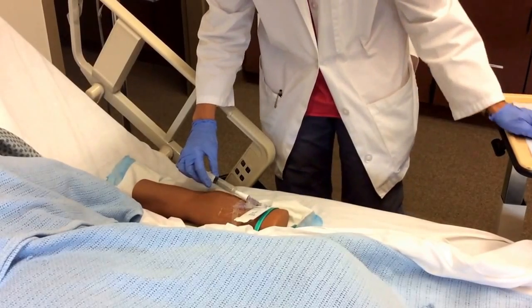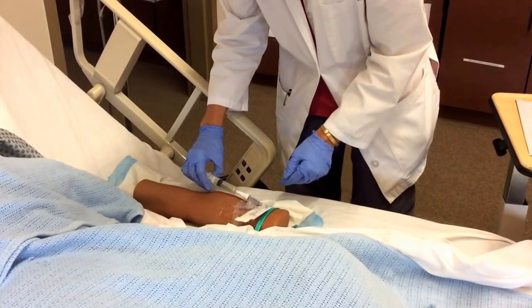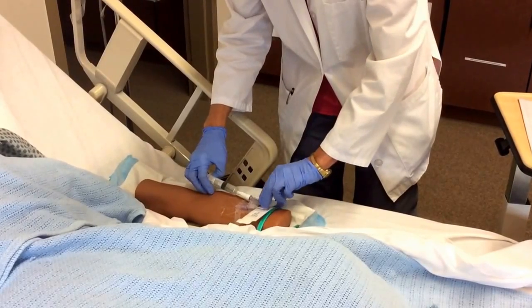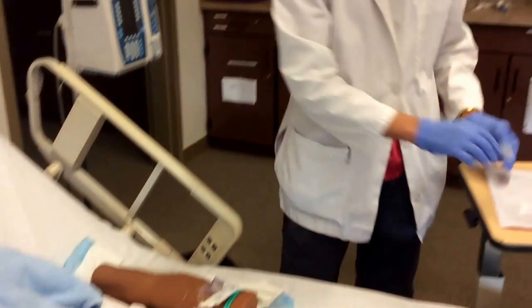And this is flushing easily. Are you having any discomfort? I see no swelling. I'm going to flush with at least 5 mL of saline. And I know this IV is patent now and ready to go.